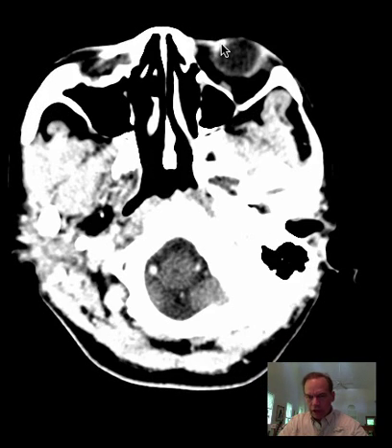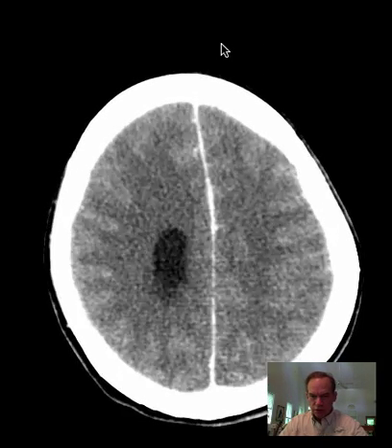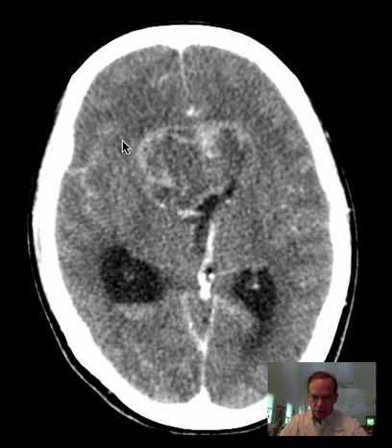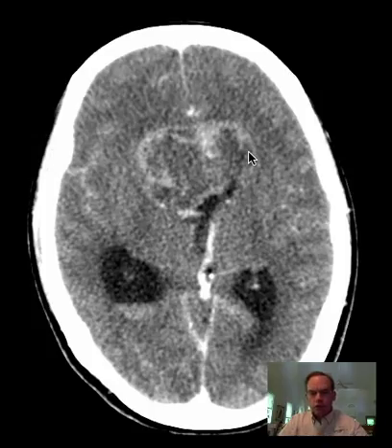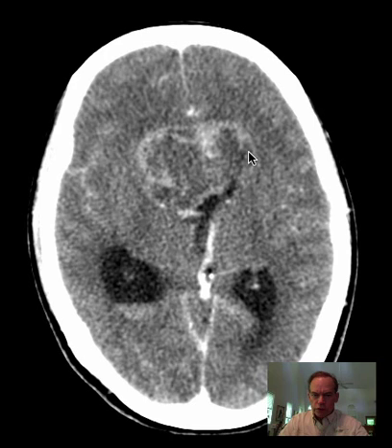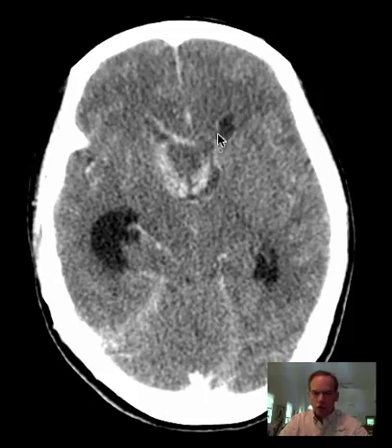Think about how you would describe, very briefly, the abnormalities you see here. I would say that there is a large mass in the frontal lobes extending across the corpus callosum. There is high attenuation material in portions of the perimeter of the mass. There is mass effect with deformity of the frontal horns of the lateral ventricles.